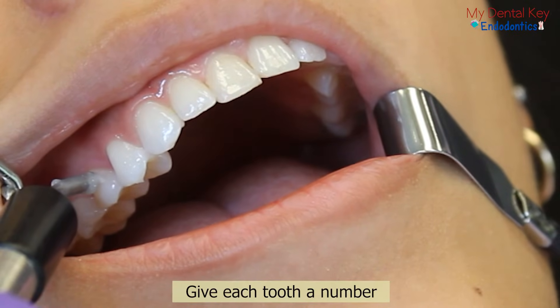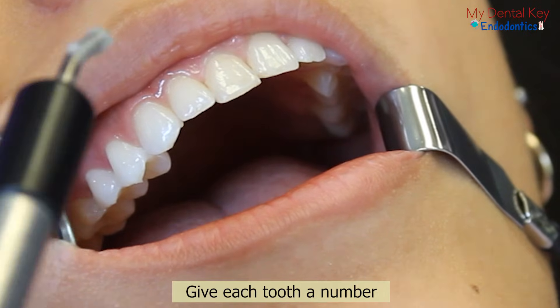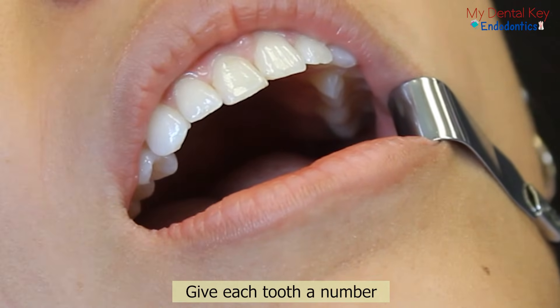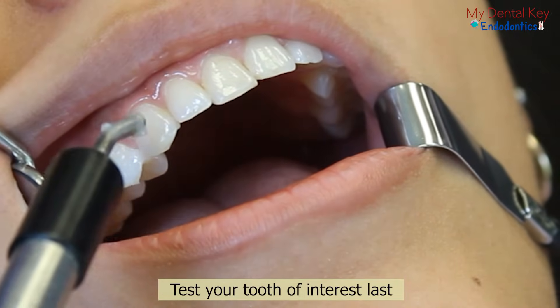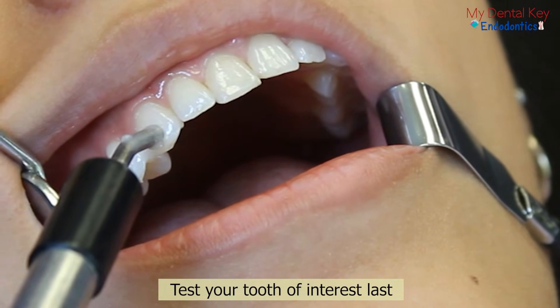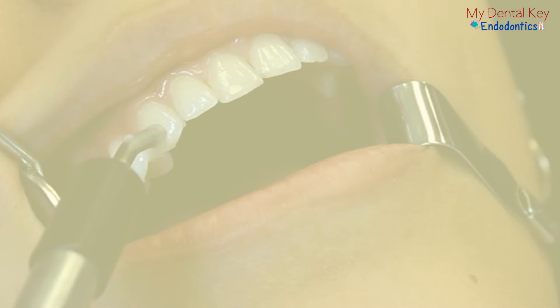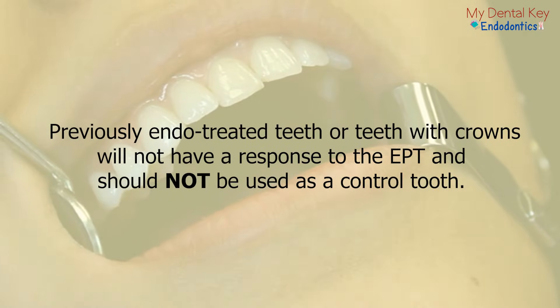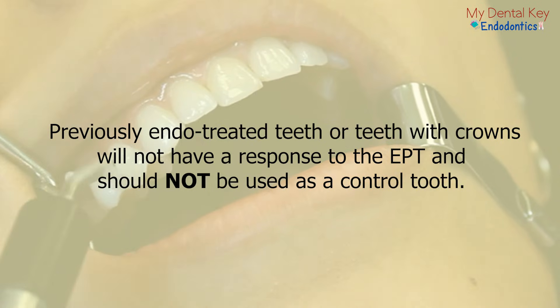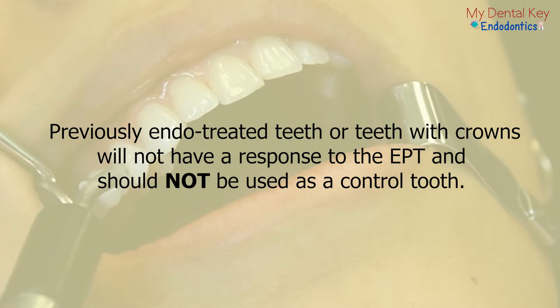Give each tooth a number and ask your patient to compare tooth number one, two, and three at the conclusion of the test. It is recommended to end with the tooth of interest in case there is any lingering discomfort. As a note, previously treated teeth or teeth with crowns will not have a response to the electric pulp test. It is not recommended to use these as your control teeth.